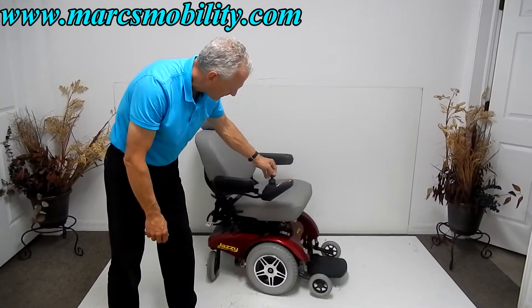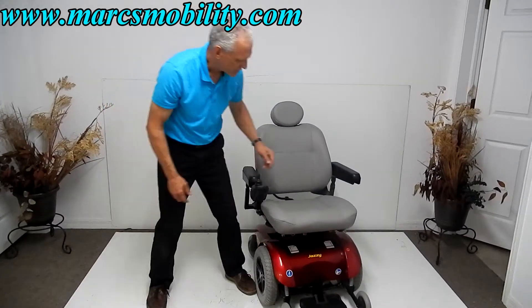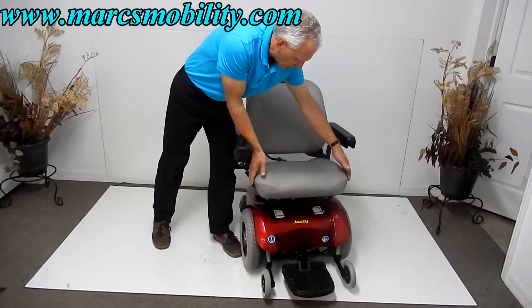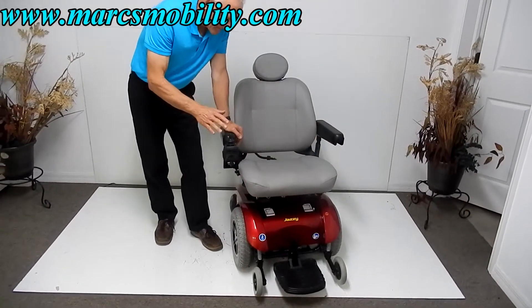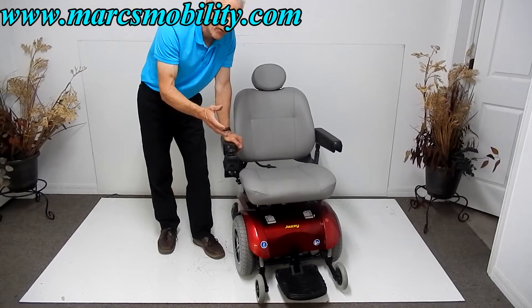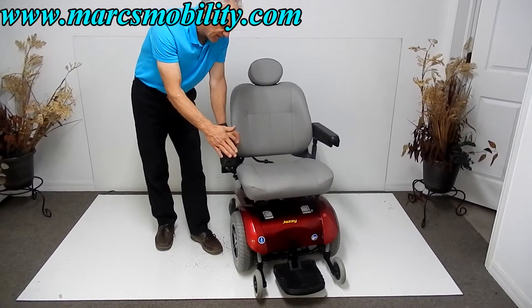The power chair has a 21-inch seat by 19 — a nice 21 by 19. This power chair is practically new; it was probably used less than three or four months.